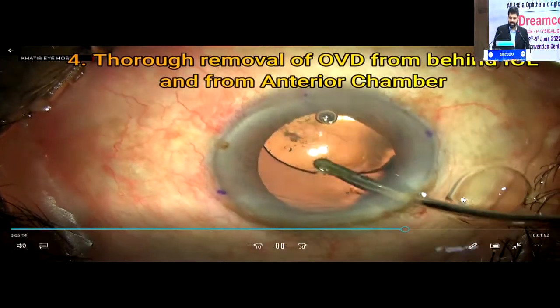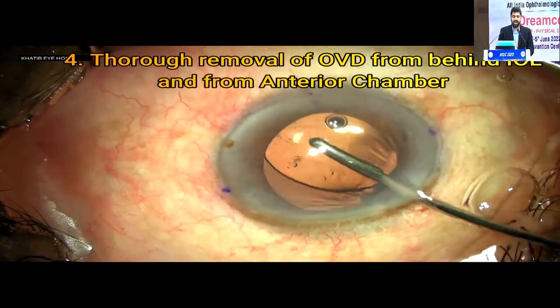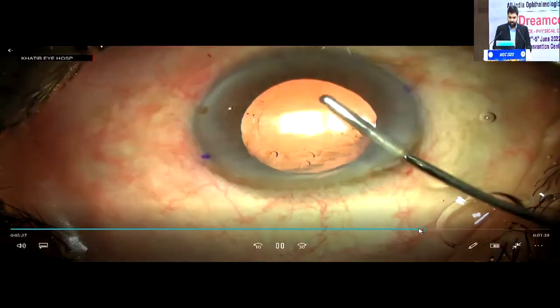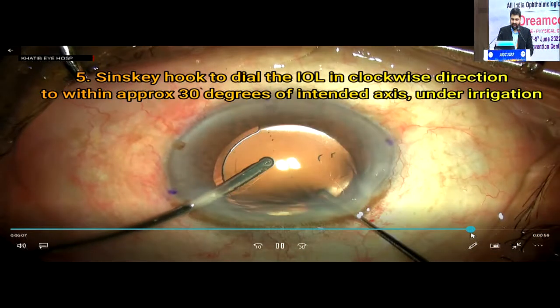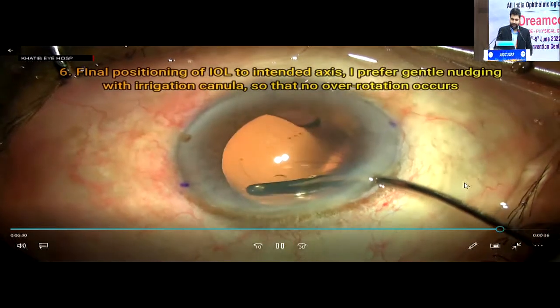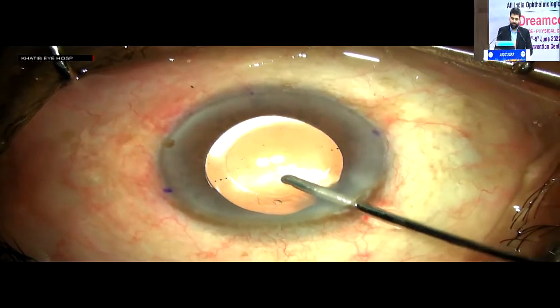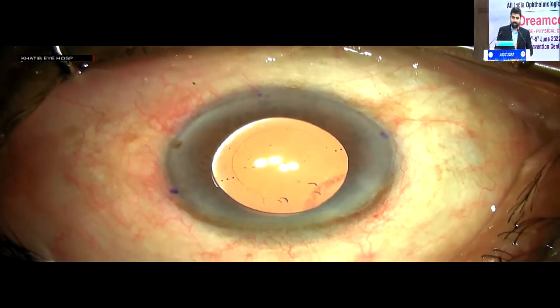Once you've implanted your lens inside, one of the most critical steps is to remove Visco very thoroughly from behind the lens, so that you get good rotational stability immediately post-op, and the Visco doesn't make the lens rotate. And then I use a dialer after removing the Visco to nudge the lens into position. And my final nudge comes from the irrigation itself, just gently nudging it into position until I feel that they are aligned with the marks. And you can see how well the lens gets aligned with the marks when you use simple point marks.